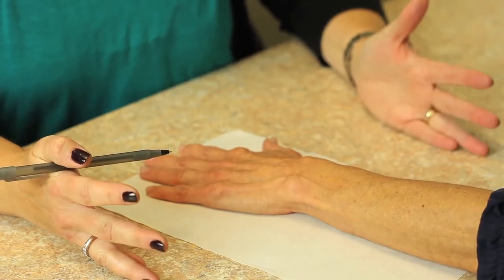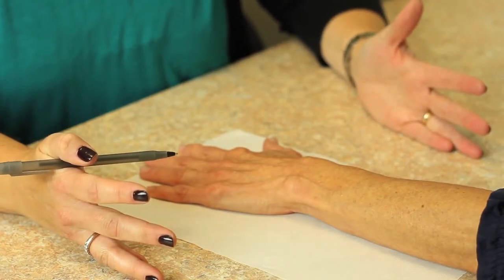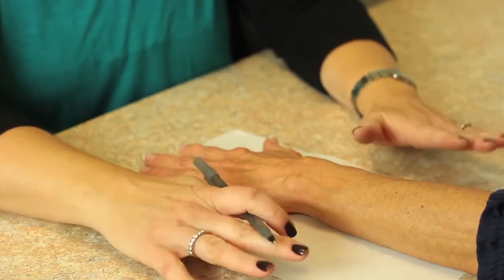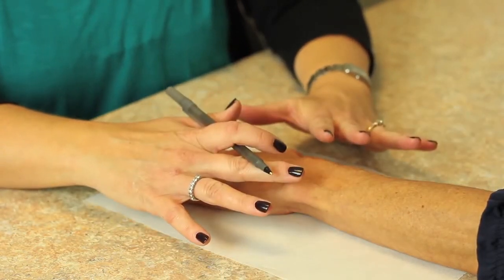So in this book we do use a pattern making approach. In order to make a pattern you need to use a paper towel and you're going to have your patient lay their hand flat down on the paper towel.